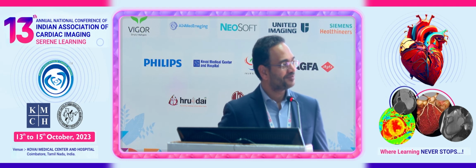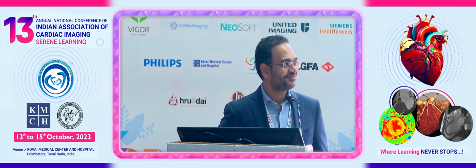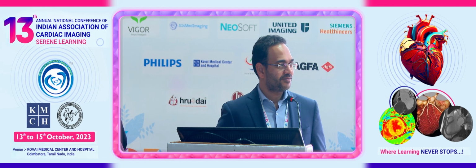I think one of the issues with high-risk plaques is the understanding, but we don't have a good study to show that these are the ones that are supposed to rupture and perhaps cause a sudden cardiac death event. Are you aware of a reasonably long-term study that has shown an increased incidence of acute coronary syndromes with increased mortality in a population of high-risk plaques, depending on the type of high-risk plaque?